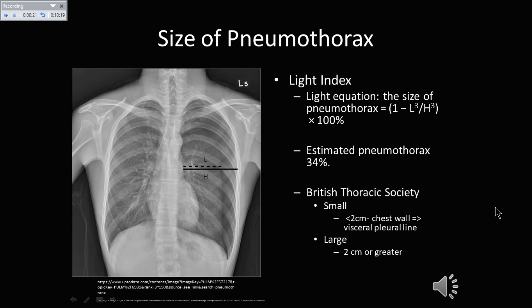There is an additional way called Light's Index. I measured from the mediastinum to the chest wall and from the mediastinum to the lung edge. You can see there is an edge to the lung with no lung markings past this area. The measurement to the lung edge was 13 and to the chest wall was 15. Inputting those two measurements — L-cubed and H-cubed times 100% — gave an estimated pneumothorax of 34%.